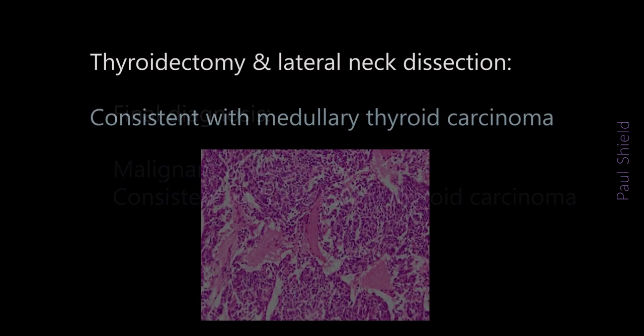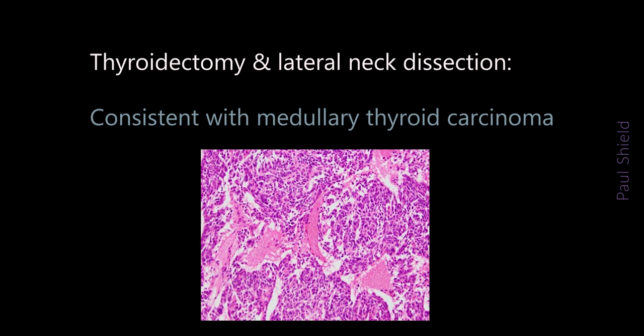The patient proceeded then to a thyroidectomy, and this confirmed medullary thyroid carcinoma with focal lymphovascular invasion. Lateral neck dissection was performed, and this showed metastasis to 5 out of 8 nodes that were sampled.